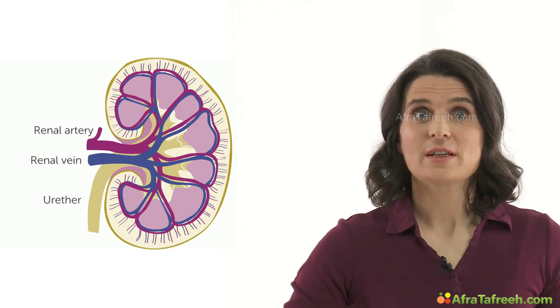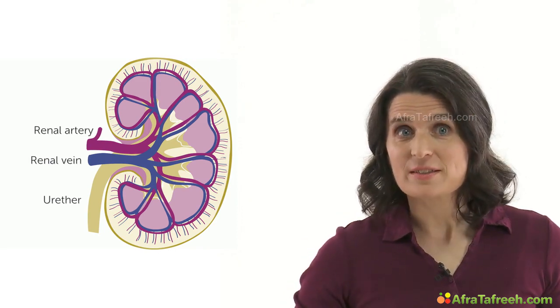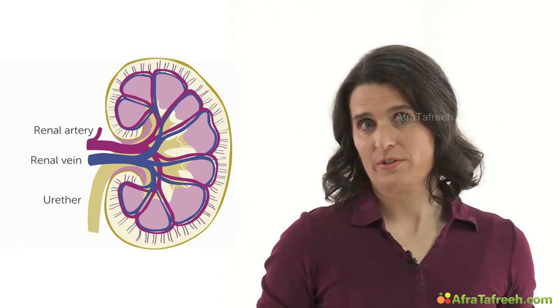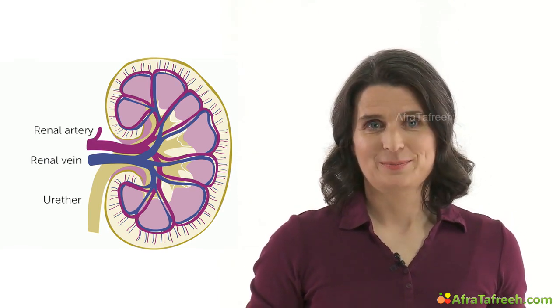Did you know that the kidneys receive about 20% of cardiac output? Amazing, isn't it? Such small organs weighing about 130 to 150 grams and getting such a lot of blood supply. Now that we took a thorough look at the anatomic features of the kidneys, we want to go and see how we can image the kidneys in ultrasound.